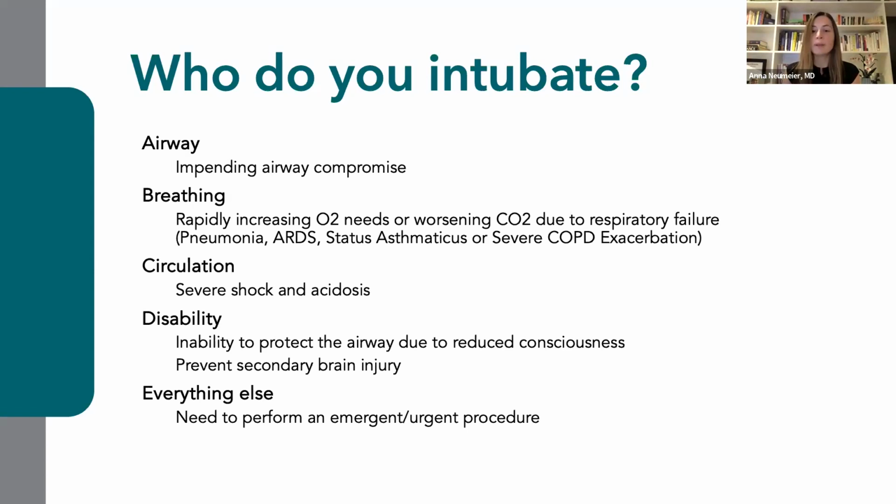Additionally, in the setting of disability or impaired consciousness, we intubate patients to help when they are unable to protect their airway, and we intubate them to prevent them from aspirating. And additionally, E stands for everything else, such as intubating in the operating room or intubating for urgent procedures.